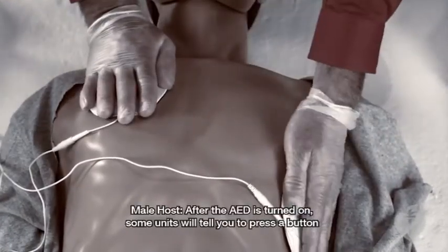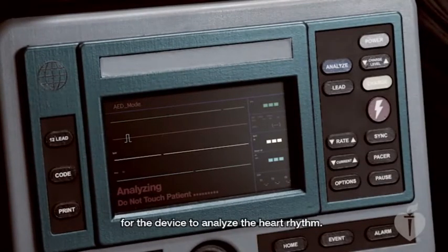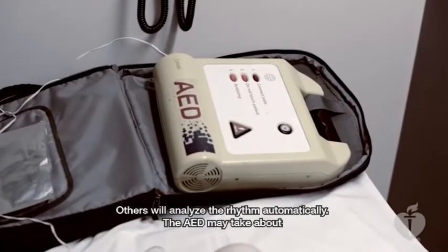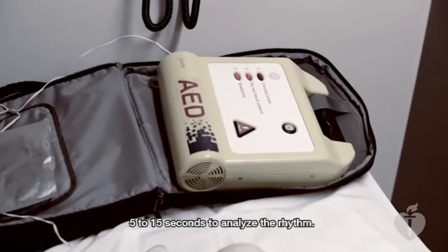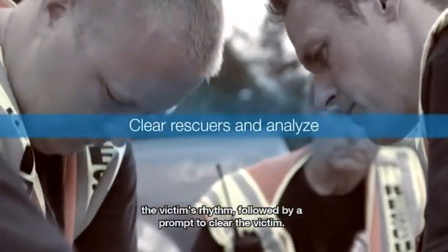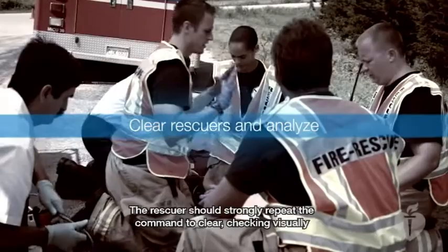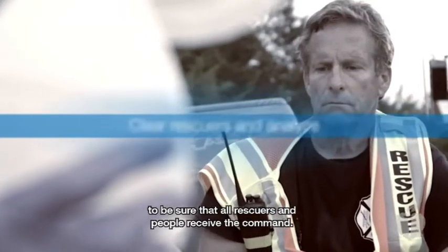After the AED is turned on, some units will tell you to press a button for the device to analyze the heart rhythm. Others will analyze the rhythm automatically. The AED may take about 5 to 15 seconds to analyze the rhythm. It will deliver an audible prompt when it's ready to analyze, followed by a prompt to clear the victim. The rescuer should strongly repeat the command to clear, checking visually to be sure that all rescuers and people receive the command.